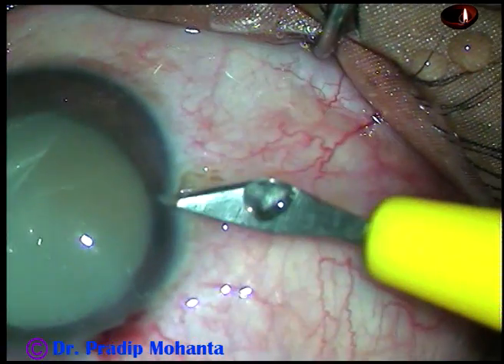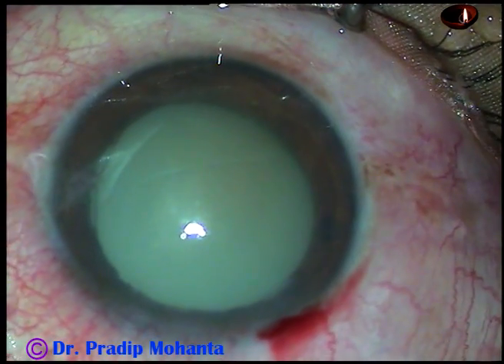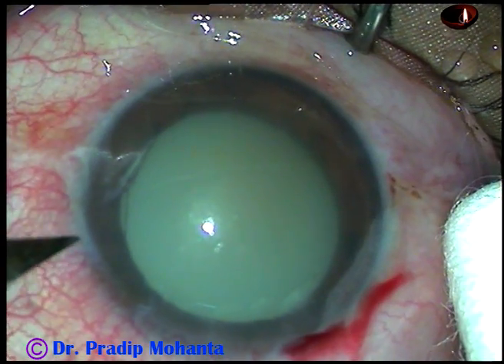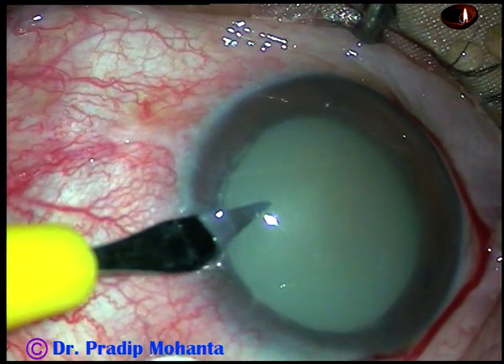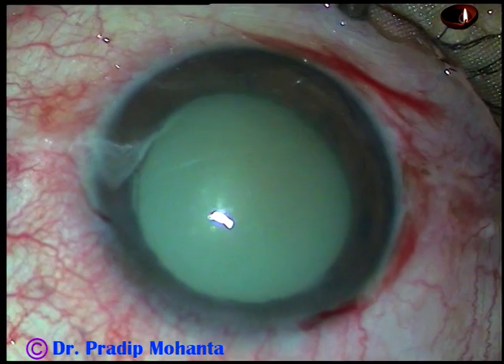With IV mannitol and other anti-glaucoma medications, the intraocular pressure has come down to 35 mm and I have taken out the case for surgery. By this time, all the incisions have been made.